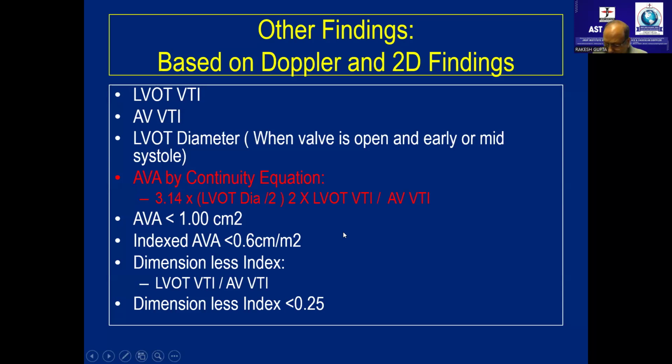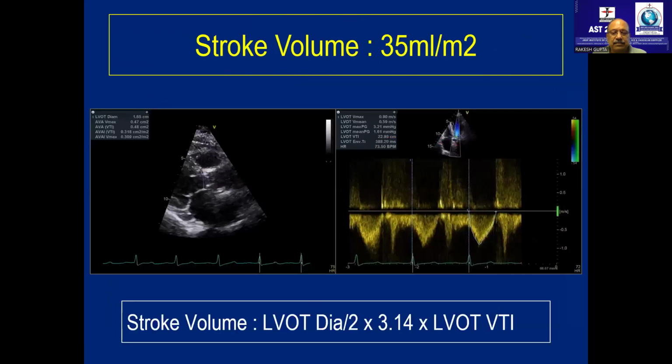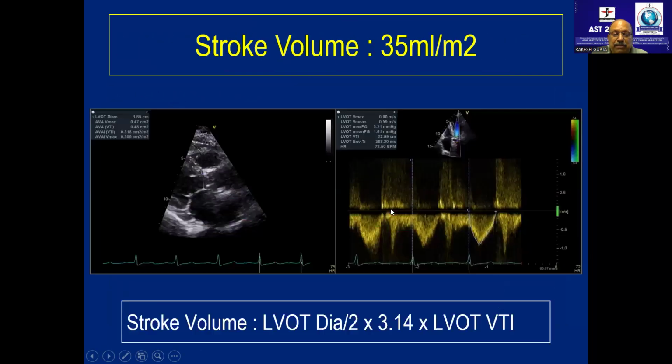Now the most important thing is, let's go back to the equation again. If I don't consider this LVOT diameter, I just look at LVOT VTI, correct? Then second is, I only look at aortic valve VTI. So what is the important thing is, I go to 5-chamber view, just look at LVOT VTI by putting a sample volume at LVOT. That will give me this Doppler spectrum pattern, correct? I calculate LVOT VTI. This is 22.99. Remember this value. I'm going to ask you again.